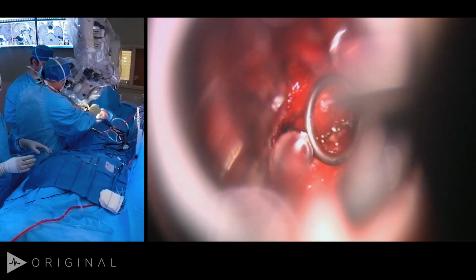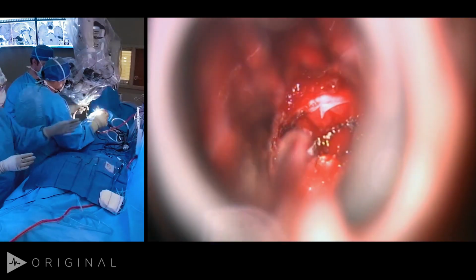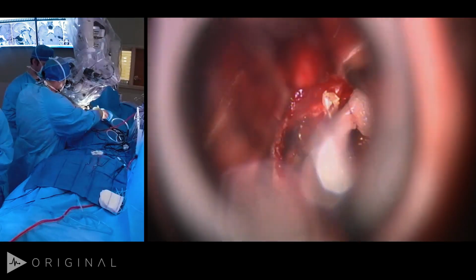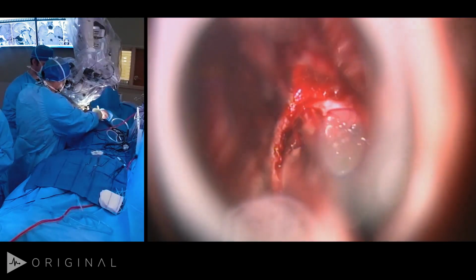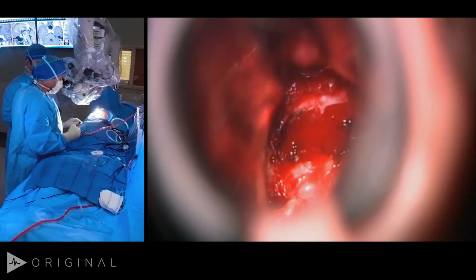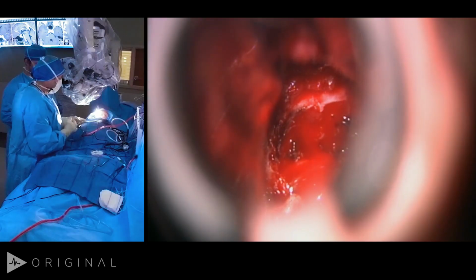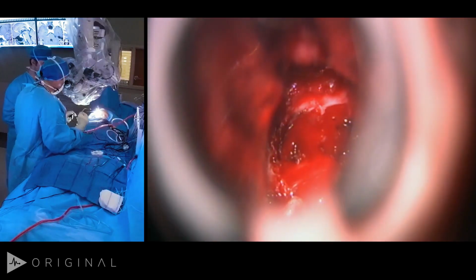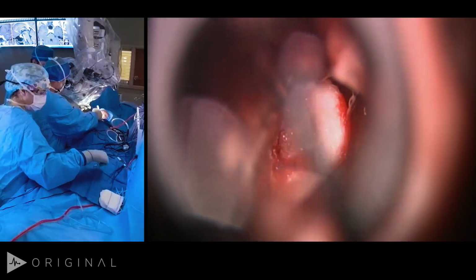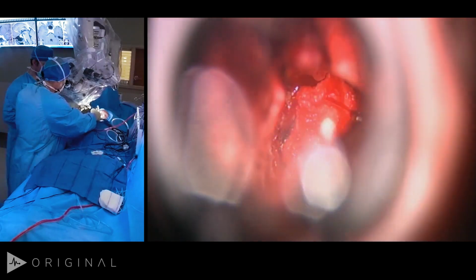I think I'm pretty happy there. I don't think we should do much more. So with that being said, could I have some gel foam, please? There's no CSF leak, so there's no need to put any fat in. Now if we just put a little gel foam right in the tumor evacuation site, that will cause the dura to compress and stop our venous bleeding without any problem. If there was a CSF leak, we probably would put some fat in, maybe some fibrin glue, maybe ask our ENT colleagues to put a mucosal flap in. But none of that is necessary here.